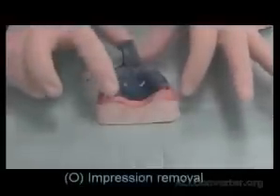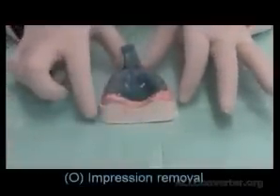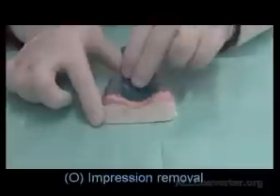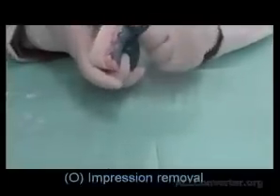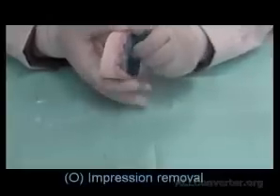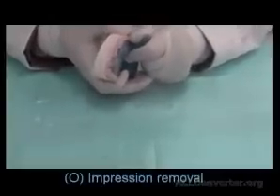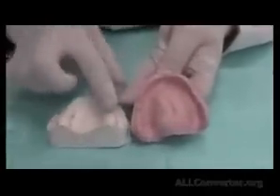So the material now is set. We have done all of the border movements inside the patient's mouth. Now we're ready to take it out. In the patient's mouth, because of the presence of saliva, removing it might be a bit easier than what we're going to do now. But on the cast, we have to just squeeze it and press it outside until we separate it from the cast. Vaseline here helps us to separate it.